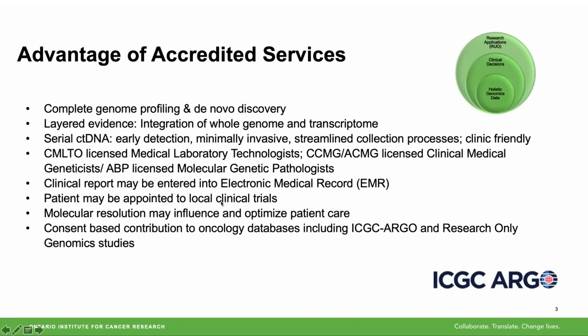These clinical reports that we will generate can be entered into electronic patient records and can allow for the appointment of patients to local clinical trials or to alter their treatment therapies based on molecular resolution that we may find in their genomic profiling. As well, the data that we generate from whole genome and transcriptome can be used for other research-only initiatives such as ICGC Argo, as long as we have consent processes in place for the individual clinical study. Next slide, please.